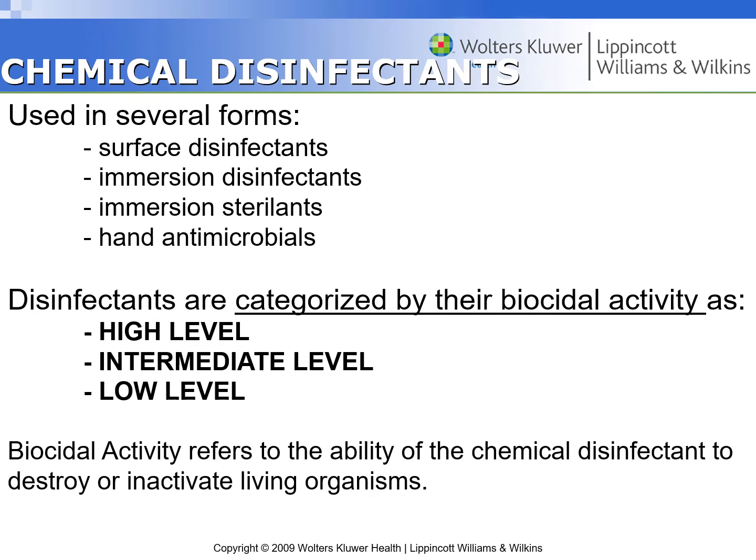We have chemical disinfectants then. Okay, so these disinfectants, what we were talking about before, have to do with our instruments and sterilizing instruments and utility gloves, which can be sterilized, etc. But now we're going to talk about chemical disinfectants, so things that we can spray on the chair, on the countertop, on different things, and what we need for those.